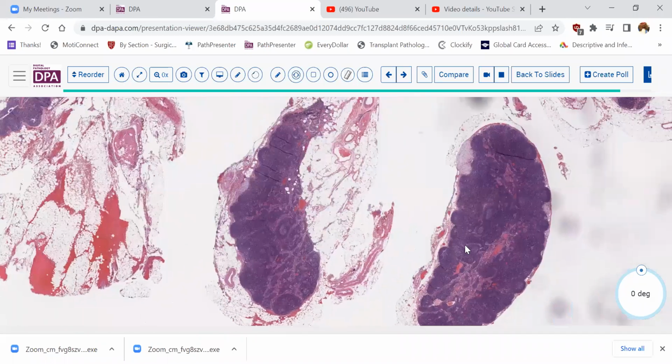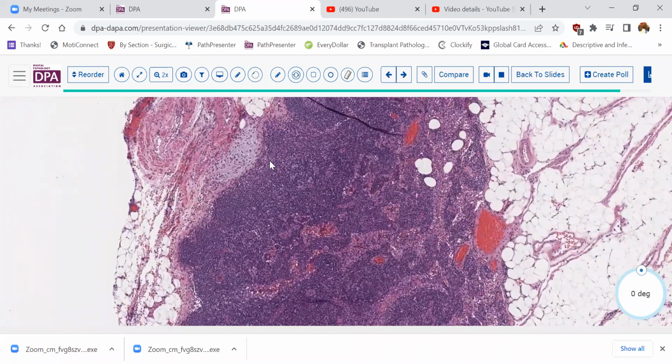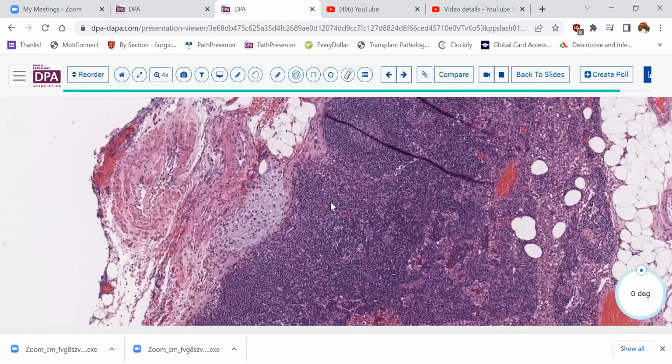So rather than diagnosing metastatic carcinoma, this was a simple decidual reaction within the capsule of the lymph node. Now, if we had seen glands here, I would have said endometriosis with decidual reaction. And I think that patients who have deciduosis without glands are certainly at a higher risk of having endometriosis elsewhere. But in fact, in pregnant patients where you do salpingectomies or something after the completion of the pregnancy, you will find decidual reaction on the surface of those fallopian tubes probably about 25% of the time. It's quite frequent in those circumstances.